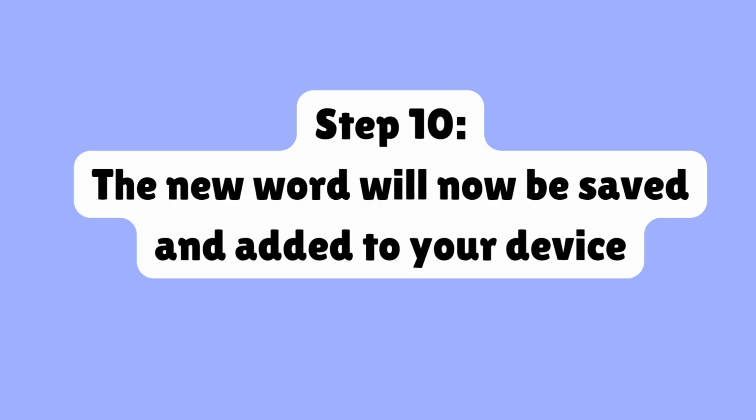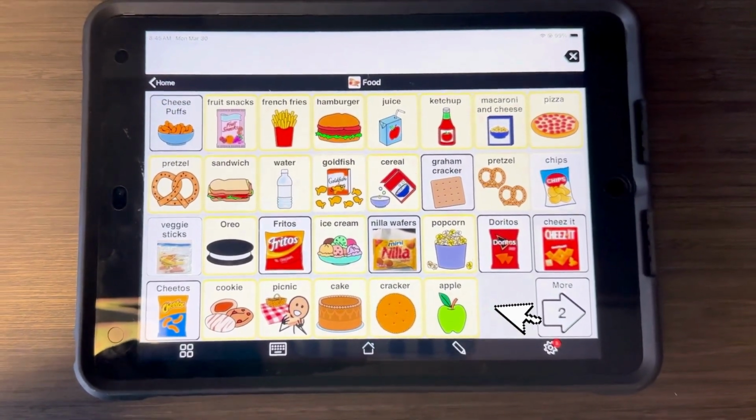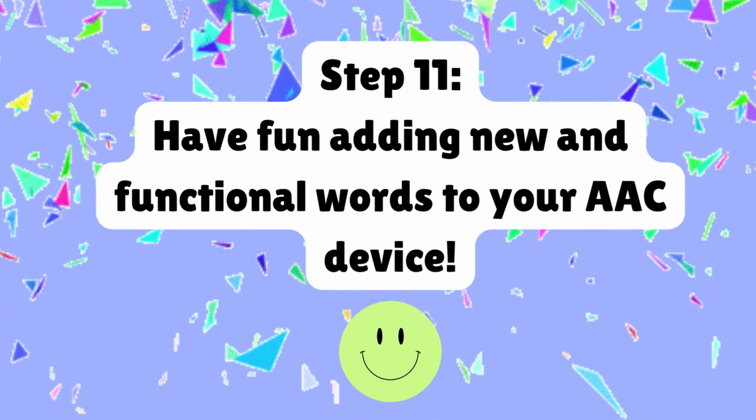Step 10. The new word will now be saved and added to your device. Step 11. Have fun adding new and functional words to your AAC device.